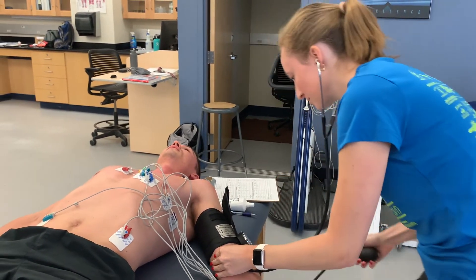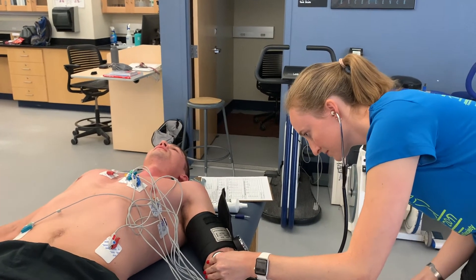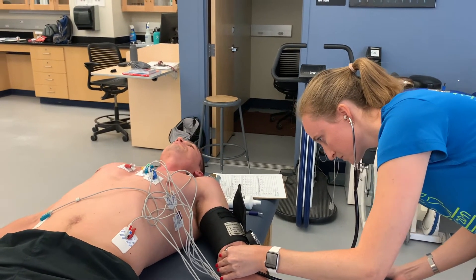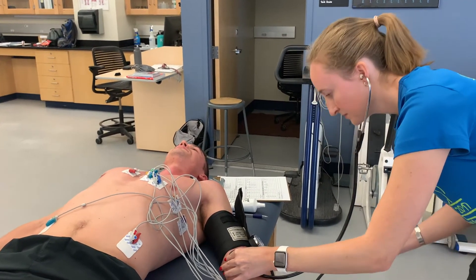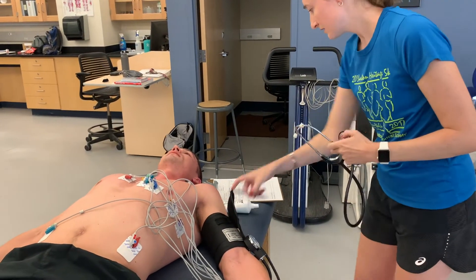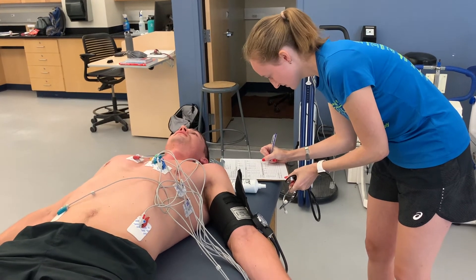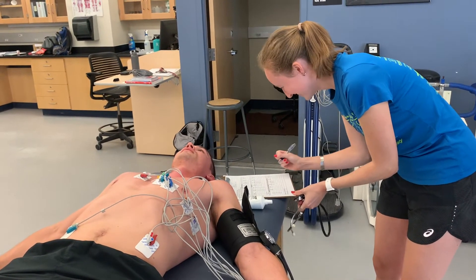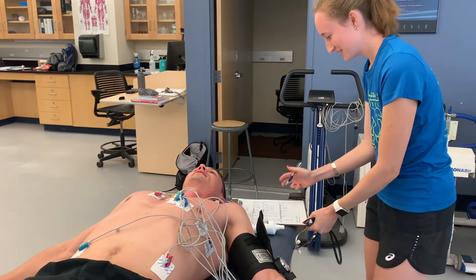I'm going to go ahead and take another blood pressure for that one-minute mark. 190 over 82, and heart rate was 83. What's your RPE looking like right now? Six. Nice.